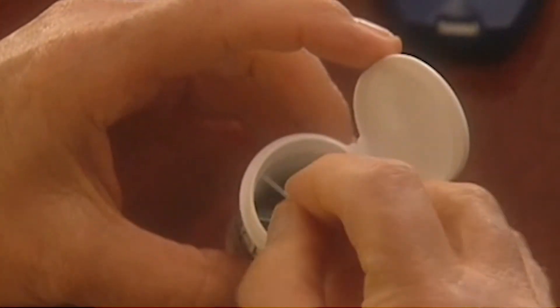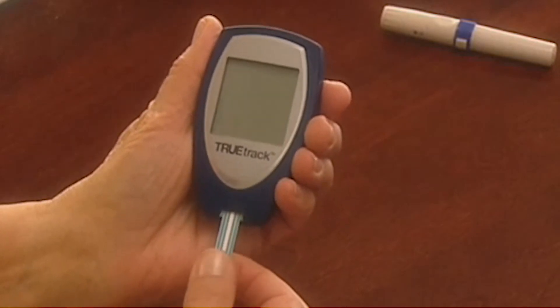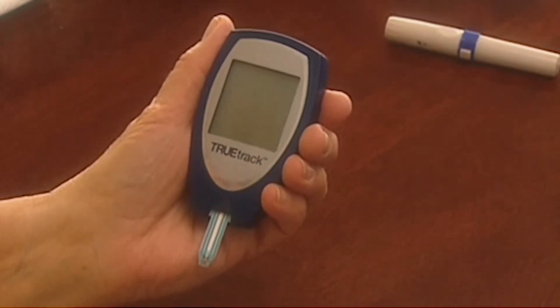Remove a test strip from the vial and immediately replace the cap. With the meter off, insert the test strip contact end, contacts facing up, into the test port. The meter will turn on automatically.